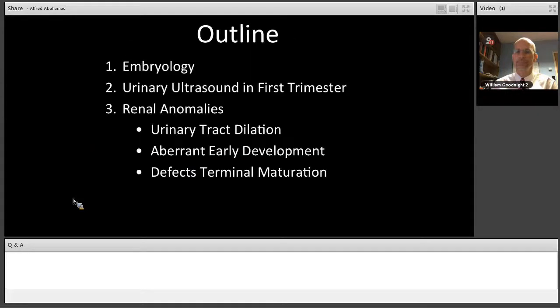So during this presentation, I'll briefly talk about embryology, probably one slide, just to introduce the concept of renal malformations. I will share with you some information on the role of the first trimester ultrasound in screening for renal malformations, and I think that's an evolving field. I just wanted you to be aware of it and to pique your interest about the usefulness of such. And then I'll present renal anomalies.